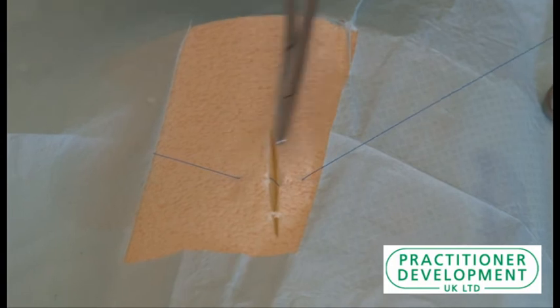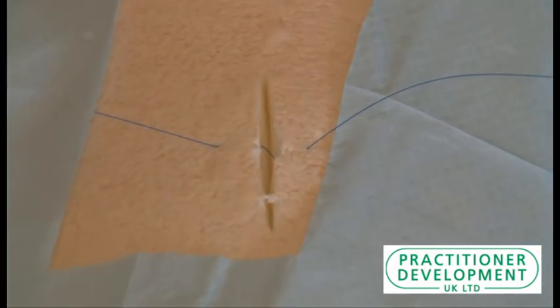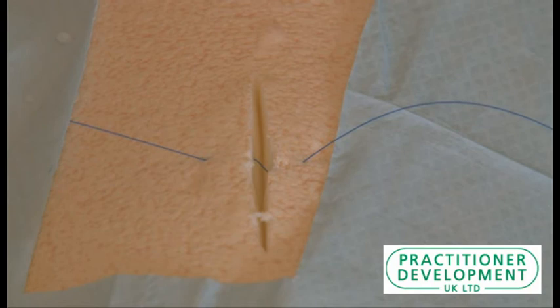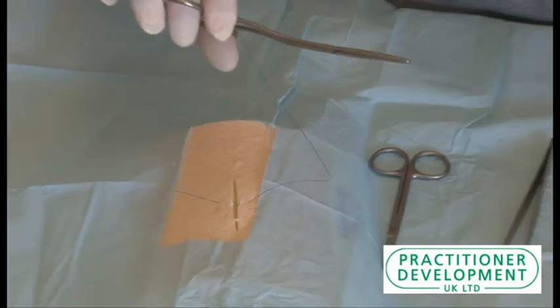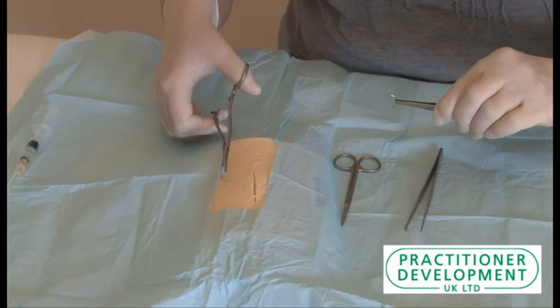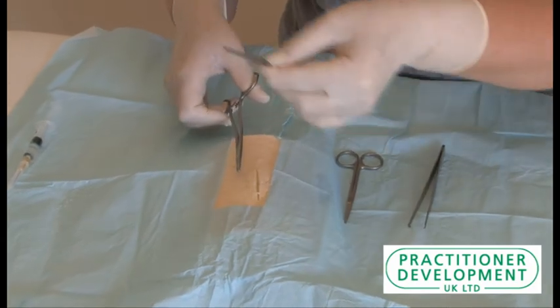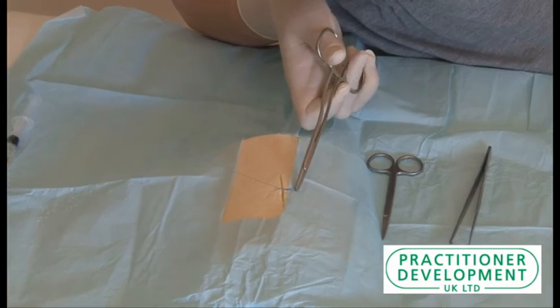So now we have the suture through, we need to tie the knot. It's easy to do about four knots here, and we start off by doing a double knot. We're going to wind around the needle holder, grab hold of the end of the suture and pull. We're going to go once round, grab the end of the thread and pull in the opposite direction.